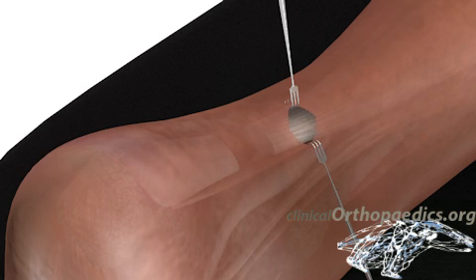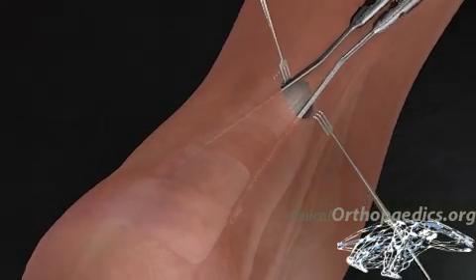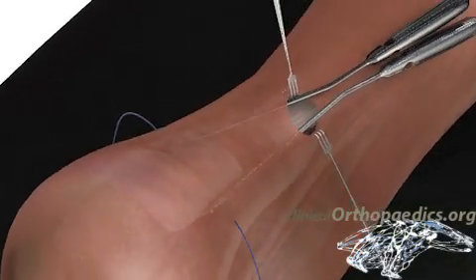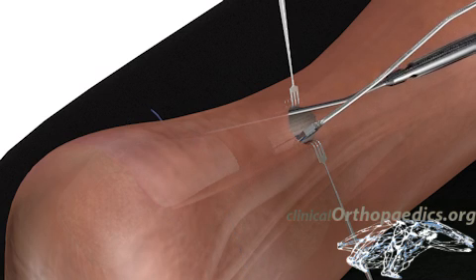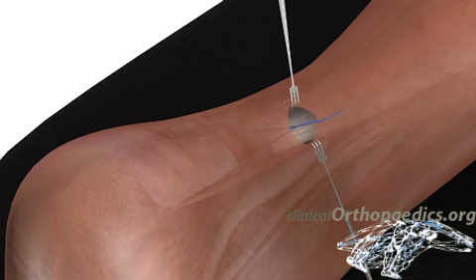The Dresden instruments are introduced into the layer on each side of the tendon. The instrument aperture is positioned approximately one centimeter proximal to the insertion of the Achilles tendon, and a needle is pierced through the skin, threading the tendon through the apertures of the instruments. The instruments are then pulled out together with the suture ends.